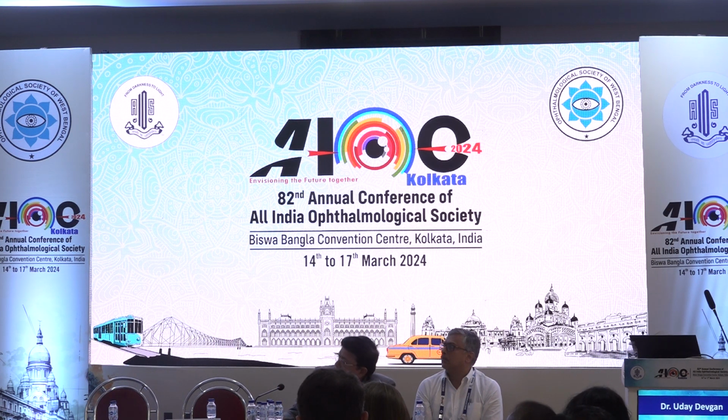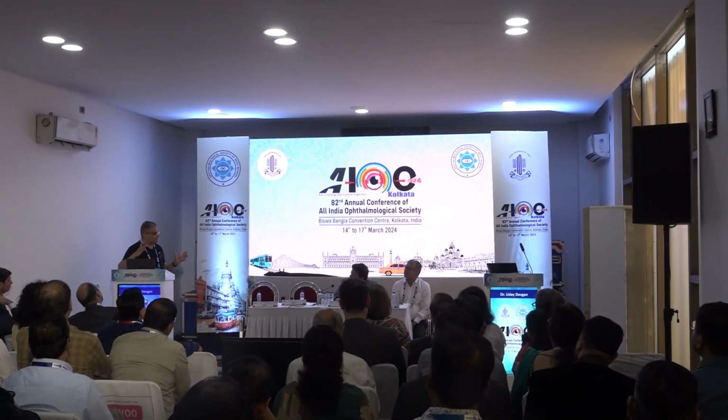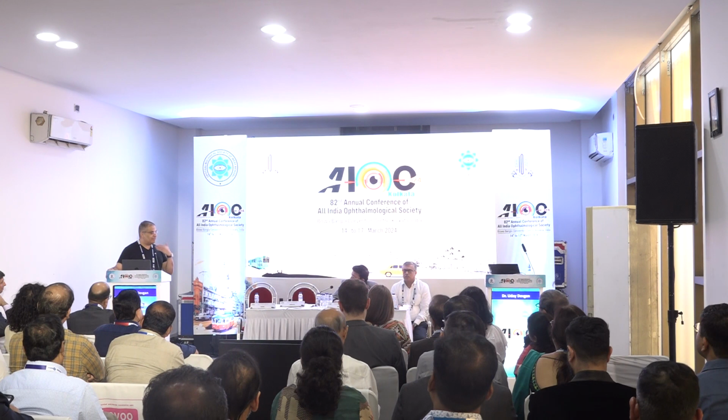Right, that makes a lot of sense. If you have a lens that has concentric target, right, that has the diffractive rings, and the patient, even in nighttime, has a 2mm pupil, you're not going to get the benefit of the multifocal. So I will not put a multifocal in someone who naturally has really small pupils, because they'll be thrilled with a monofocal. I'm not in the game of selling lenses.